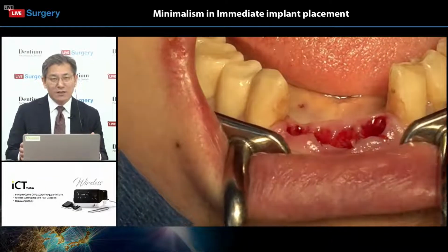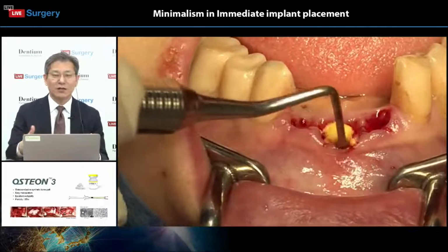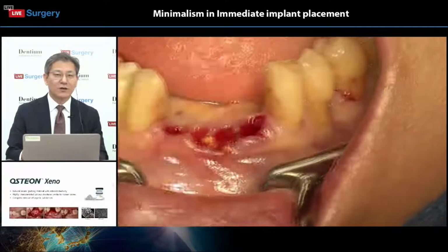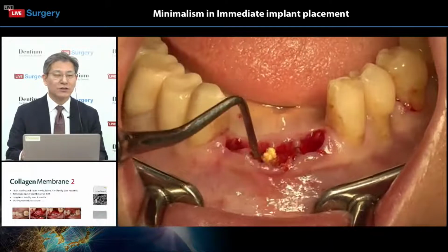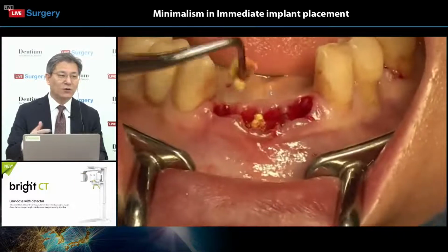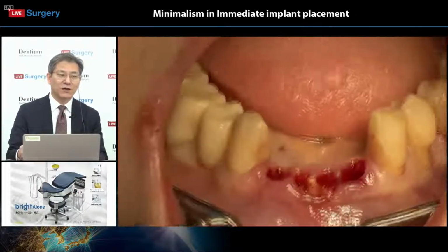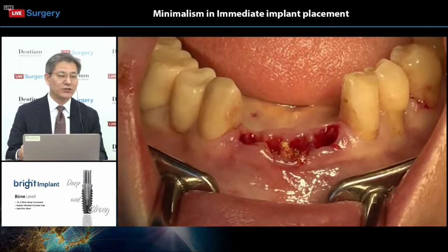So between 8 weeks and 16 weeks, all the implant procedures should be done because this time period is stable and safe for implantation. Why? After 8 weeks, we can use all the soft tissues because of socket sealing by soft tissue ingrowth.